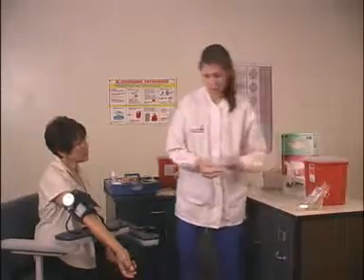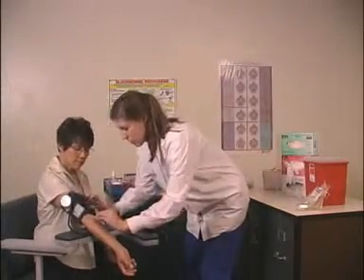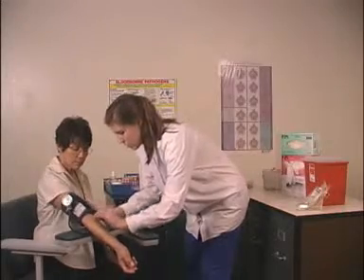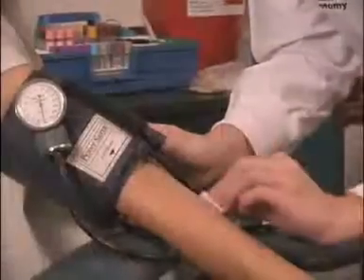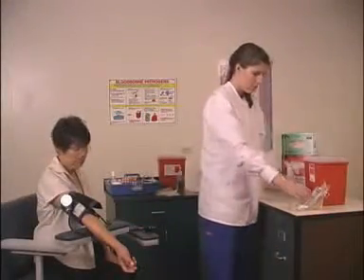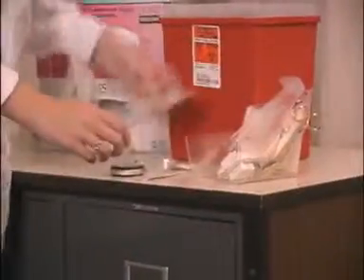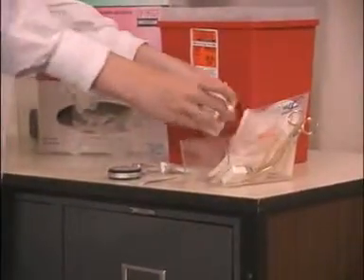Select an area on the inner volar surface of the forearm, distal to the antecubital area, and devoid of surface veins, scars, or bruises. The lateral aspect is preferred because using the medial aspect tends to cause more pain and has a higher incidence of scarring. It may be necessary to shave the test area lightly if it is covered with a large amount of hair.